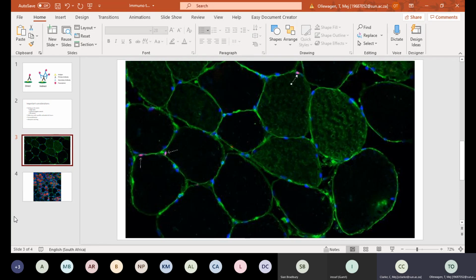And we know definitely that the border and the fiber type are different, but because we know the distinct location of each, we can stain both with 488, and that allows us to keep open a different wavelength, like we're using 555 for the satellite cells that are focused over there. So that does open it up.